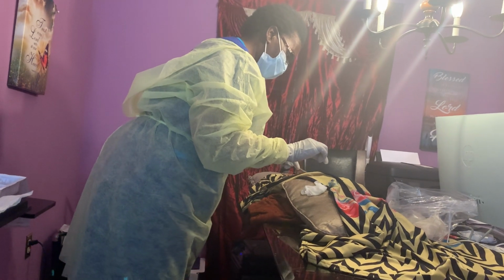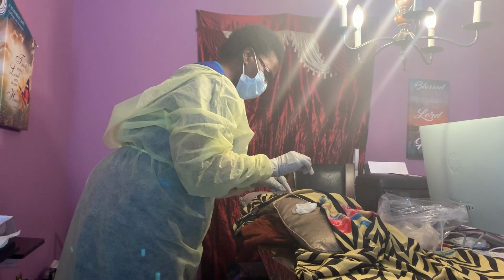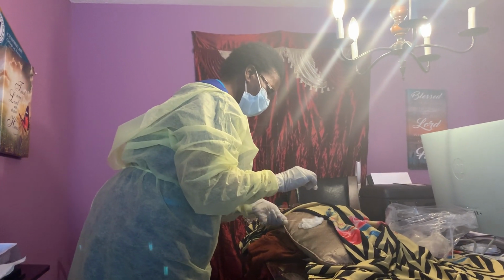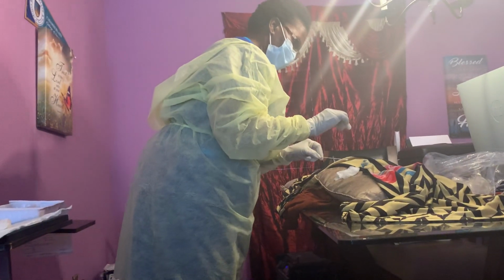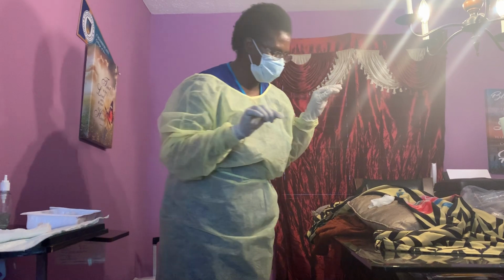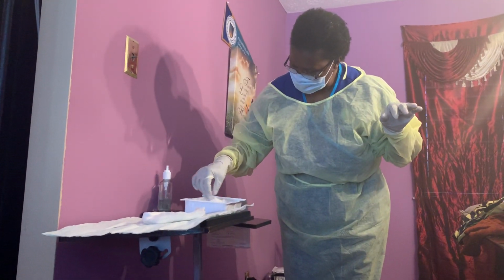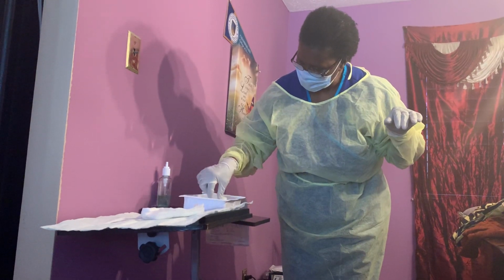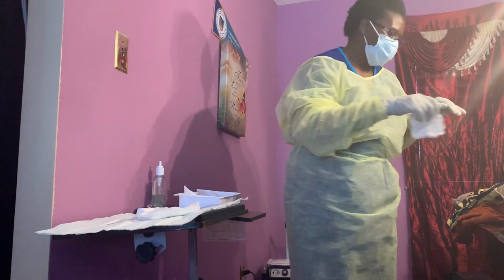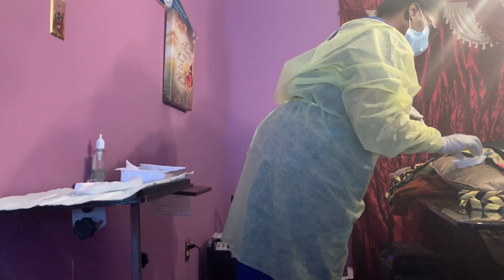Everything is well packed, and because this gauze is wet, it's a moist to dry dressing, which helps to debride also. And after that is done, I trash that. Then I'll use my sterile hand to pick up a clean gauze, a sterile gauze, that one, and put a sterile dry gauze on top of the wound.